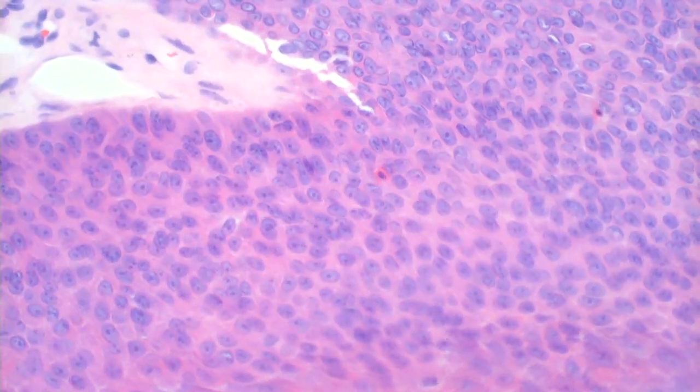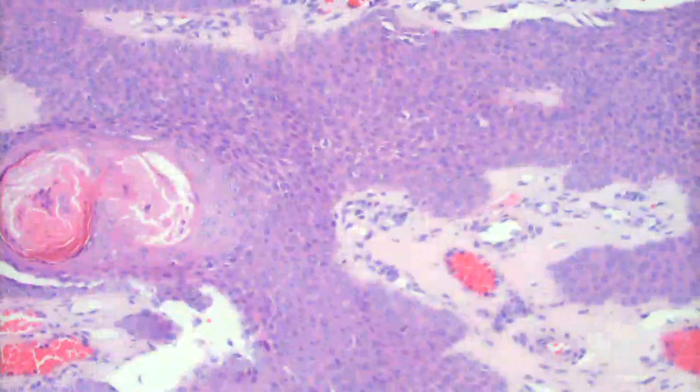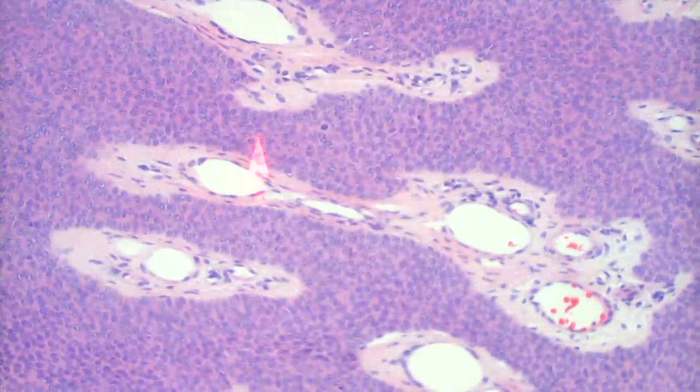Usually when we think of necrosis, we think of malignant. But in the poroid lesions, it kind of breaks the rule a little bit. So just realize that can happen. It doesn't mean that it's malignant. So this one doesn't have any mitotic figures, but it does have a couple of necrotic keratinocytes. Yeah, there's a mitotic figure. Okay, see one right there?